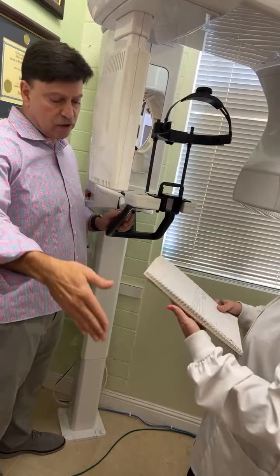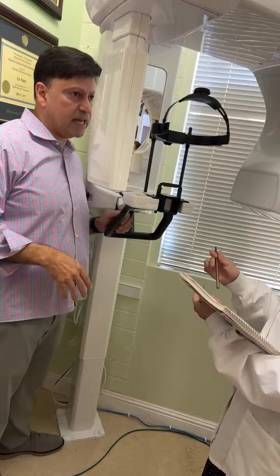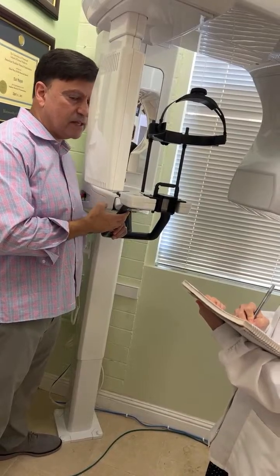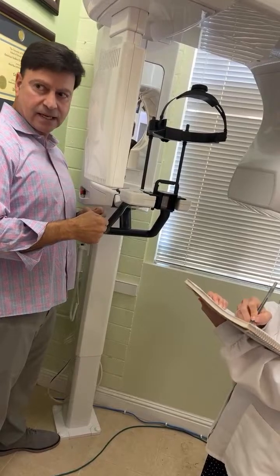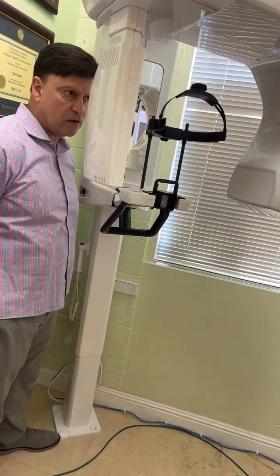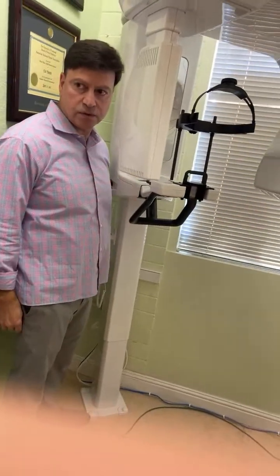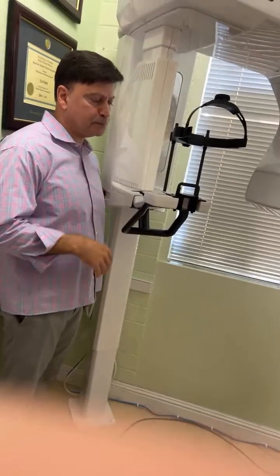So get a chair that you can scoot under here, get them under all the way and do everything as if they're standing. No hands on this, because they don't need to stabilize themselves, and sometimes they tend to shrug. So have them relax, sit their hands under their legs and pull their shoulders down. That'll help open up the space so this doesn't hit the shoulders. You can do that for panos, CT, etc.